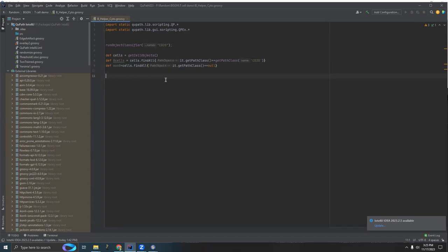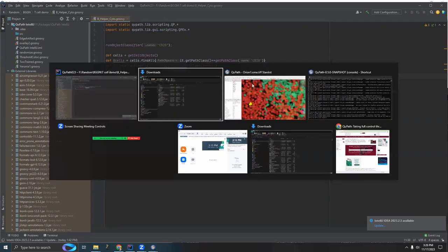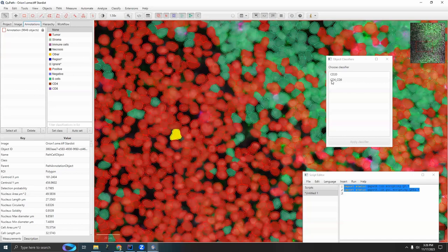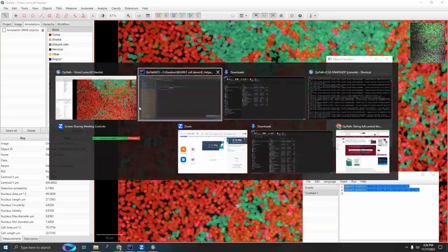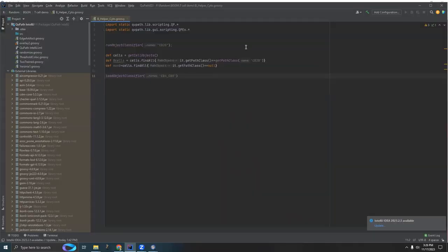Now that I found my non-B cells, I need to tell QuPath which classifier we're going to apply to that. And we do that through load object classifier. And I could just type in the name, which I believe I called CD4_CD8. Let me go back to QuPath and check. Yep. It is important to get this name exactly right with all of the capitals and the underscore and everything. So I'm going to load the object classifier CD4_CD8, and I'm going to call that T cell class.